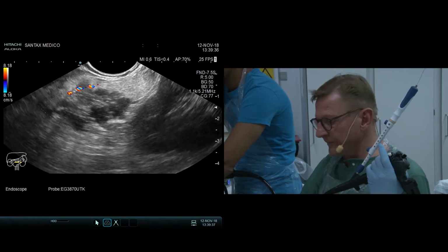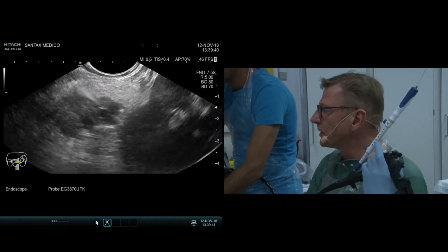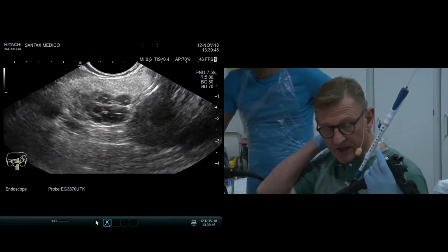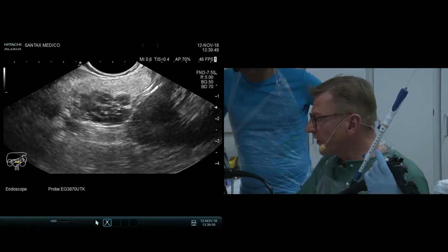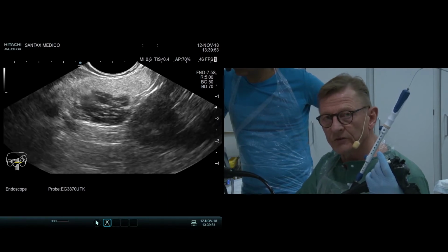Yeah, contrast is the next question. That could be an option. I don't think we have time for that for this case. So to us, I think it's more of getting a diagnosis based on histology.